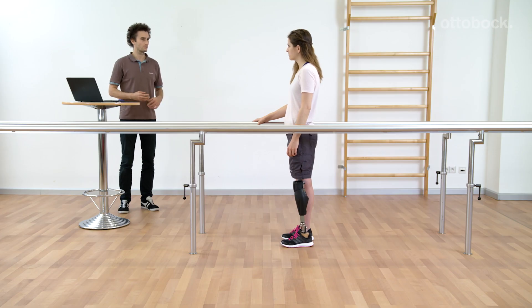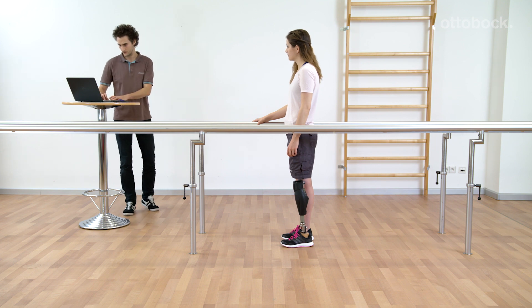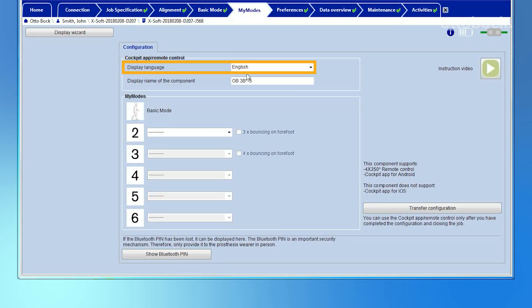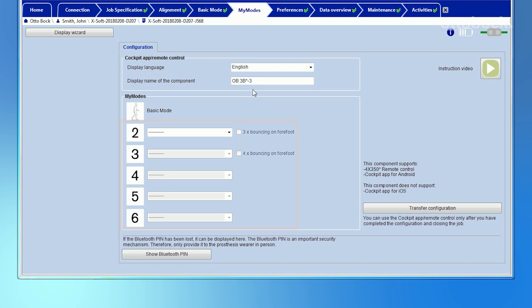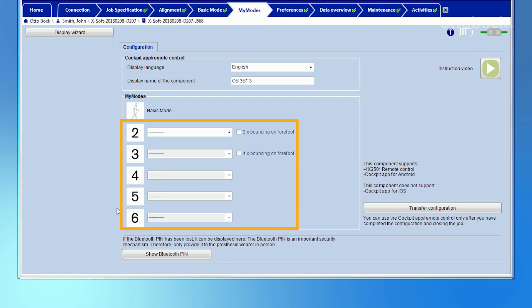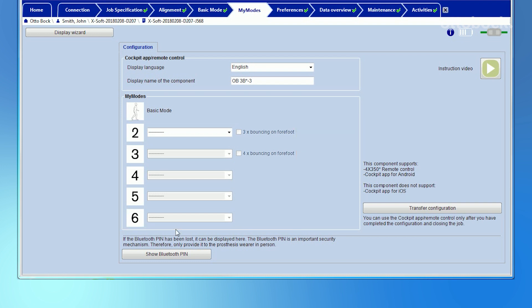A lot of individual settings are possible with the help of X-Soft. The CPO can determine the cockpit app language and the name of the knee joint. There are five individually adjustable My Modes. These My Modes are adjusted by the CPO and can be activated by the user via the cockpit app. Additionally, the user can activate the first two My Modes with a special motion pattern. The special motion pattern has to be selected in X-Soft for each My Mode.